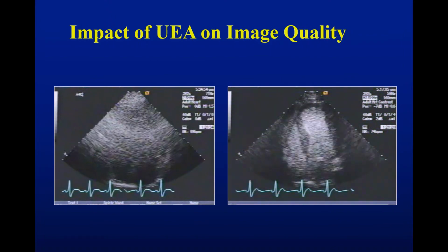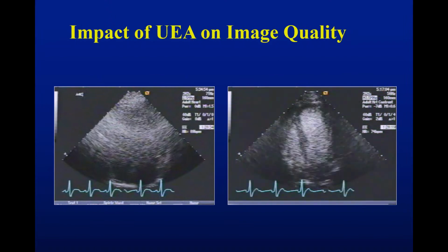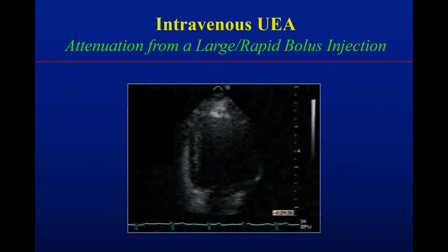And I emphasize that because, yes, we can get some reimbursement for these contrast. This is not a money-making machine, by no means. So the driver for such utilization is really the quality of the images, particularly to answer the clinical question that you're aiming for. So it is the champion of quality in a laboratory that would push appropriate utilization of ultrasound enhancing agents for such.